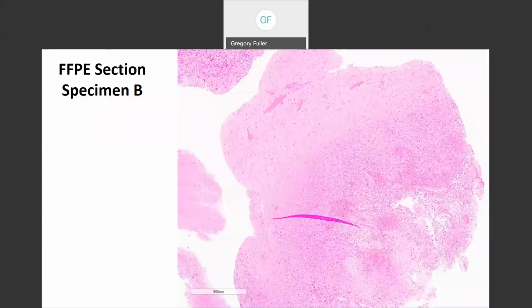All right, here is specimen B. That was specimen A. Look at B. Oh, this is quite a different story. Have a look at this. Look at the far right corner. That is necrosis, and then look at the dense cellularity bordering it. As we go all the way out to the margin, that is the cortical ribbon. It looks relatively normal. This is what we received as specimen A for frozen that was read as normal, negative.